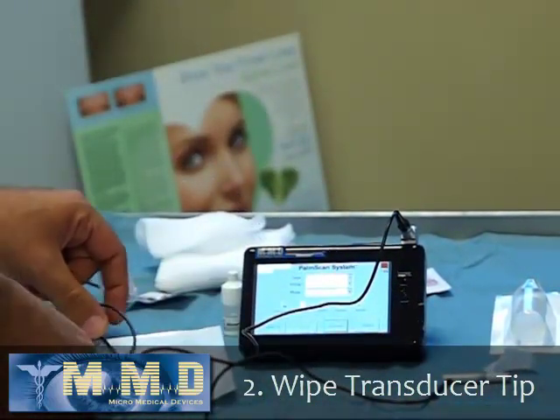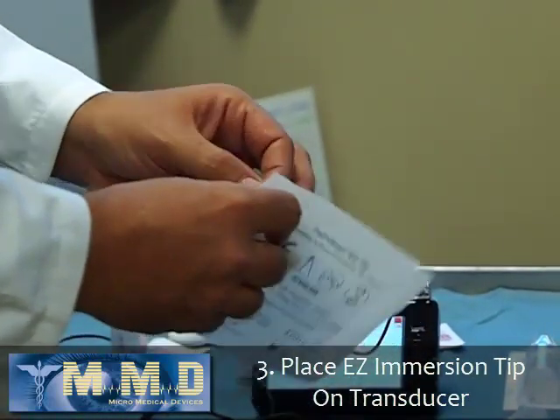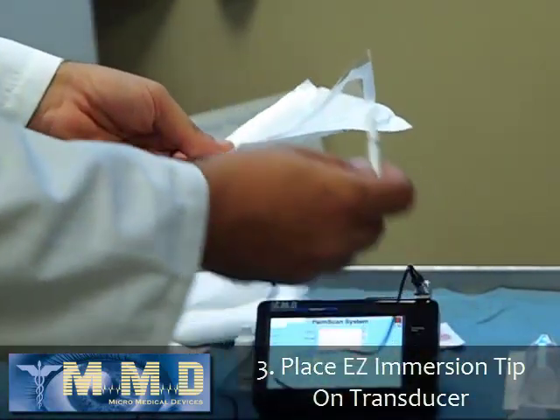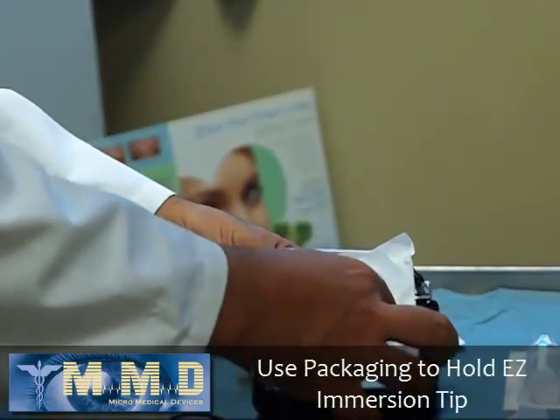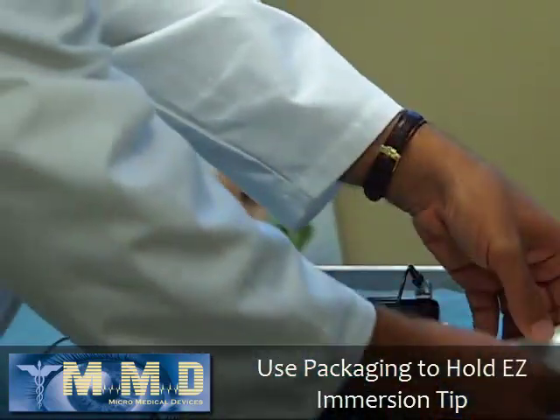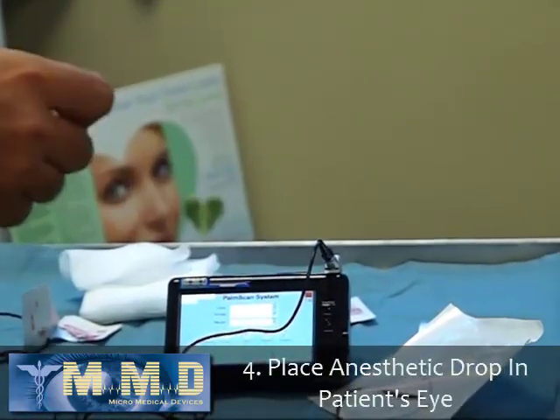Now I'm ready to place the Easy Immersion Tip on the transducer. To do that I just hold the side of the package and insert the transducer inside the package, being careful not to touch the tip. I leave the transducer and the tip inside the box and install the tetracaine drop in the patient's eye.